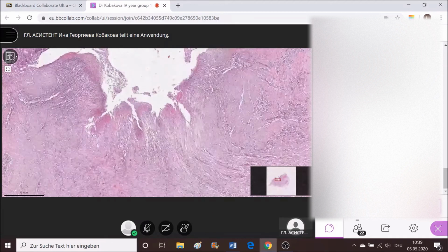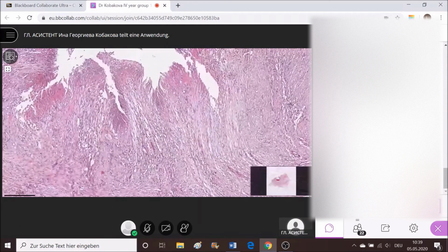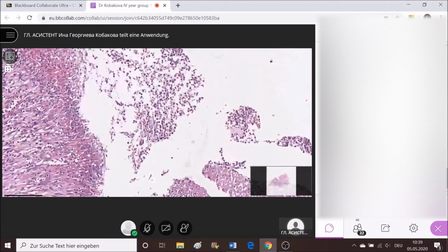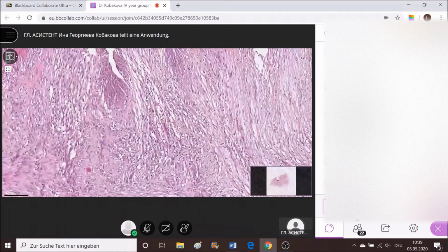which later continues with a small amount of acute inflammatory infiltrate. You can take a look at the neutrophils here, majorly some which could be found inside the desquamated material. They're looking lobulated with a couple of nuclei combined together. And later, this tissue continues to what? What is this type of tissue that we're observing here? This is granulation tissue, the repair tissue, which is positioned under the fibrinoid necrosis.